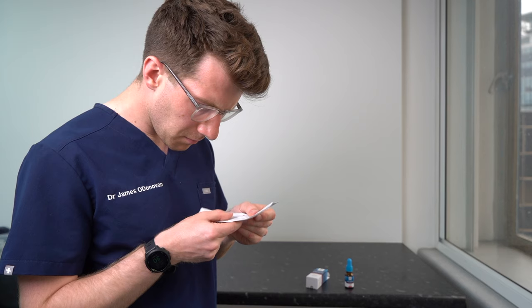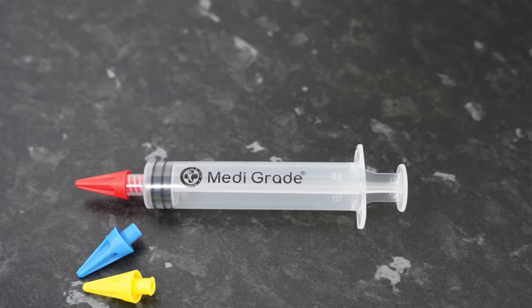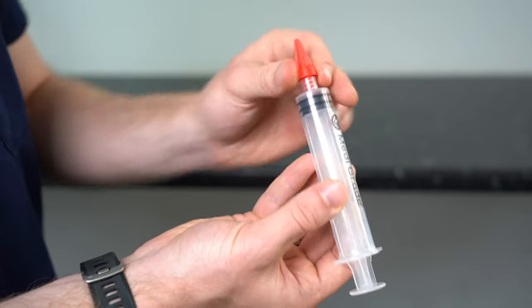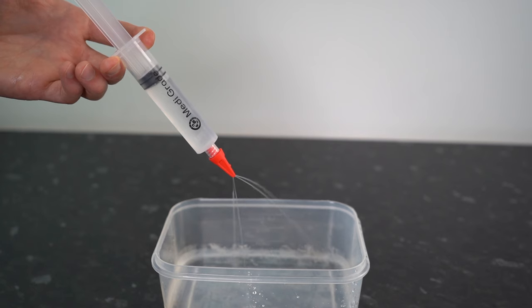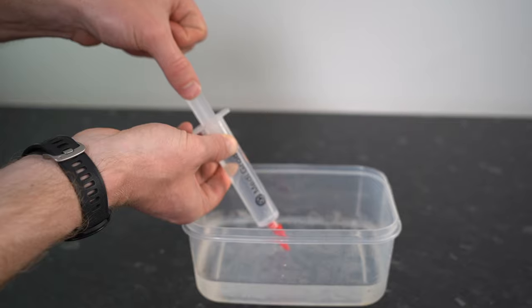Before you start this procedure it's important to read the full information leaflet inside of the box. Next, take the kit out of the box and apply one of the lure locking quad stream tips to the syringe by twisting it clockwise until it's tight. Now these tips direct four streams of water into the ear canal walls and not directly at the eardrum. Next, fill the syringe with room temperature water that you boiled earlier. You're now ready to do the ear washout.